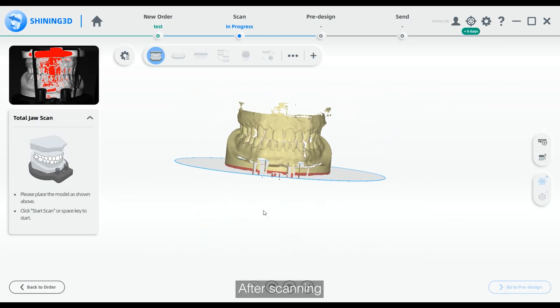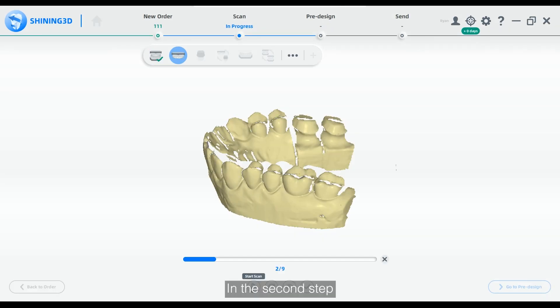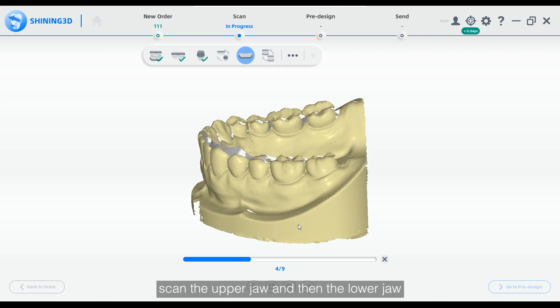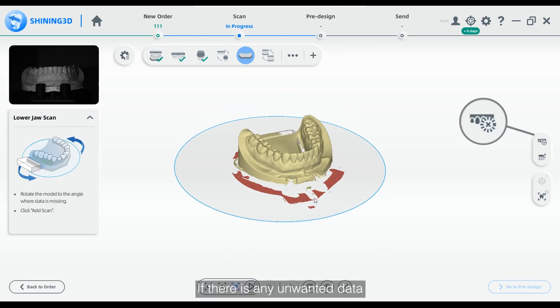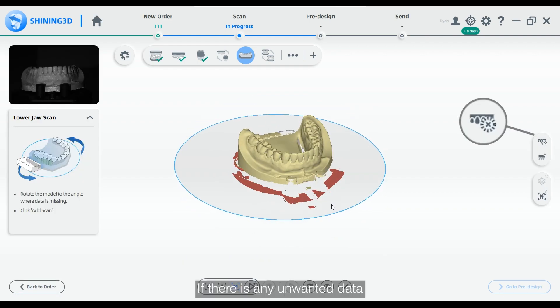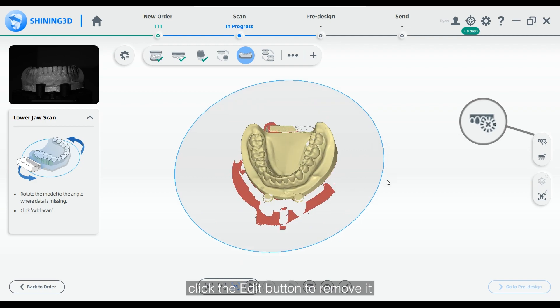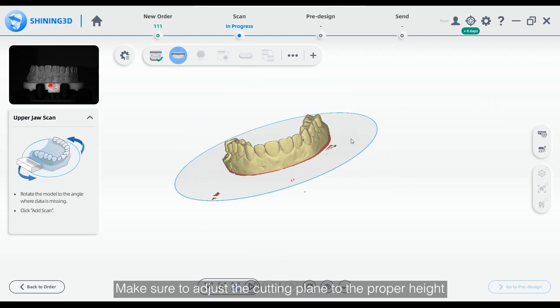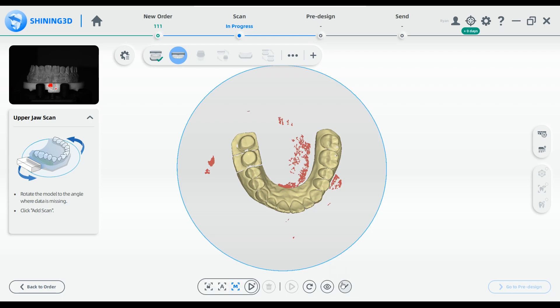After scanning, please confirm the data. In the second step, scan the upper jaw and then the lower jaw. If there is any unwanted data, click the Edit button to remove it. Make sure to adjust the cutting plane to the proper height so that it can delete the fixture data.